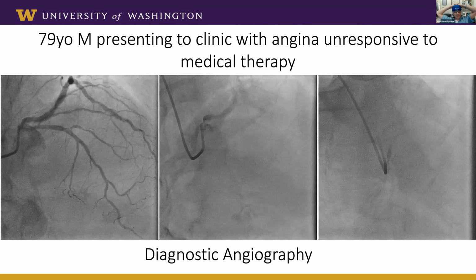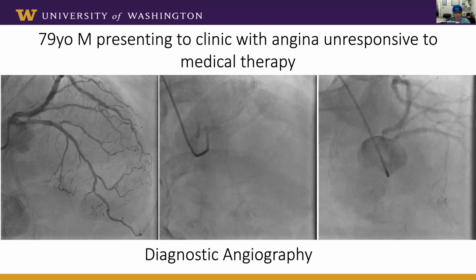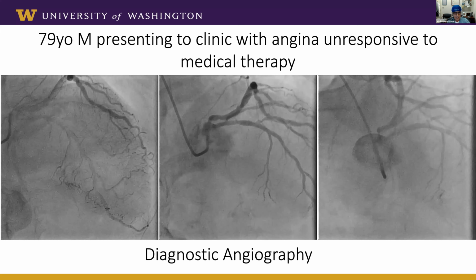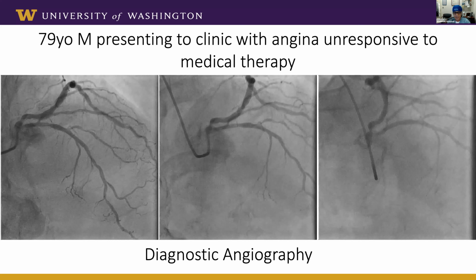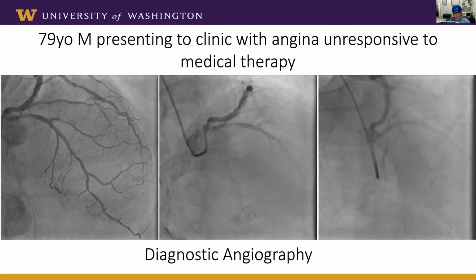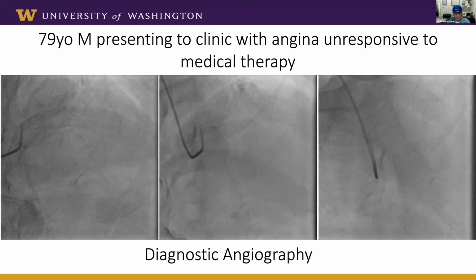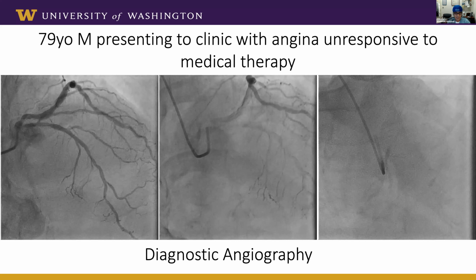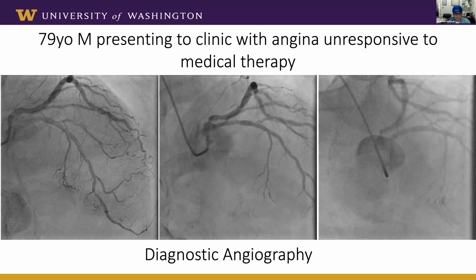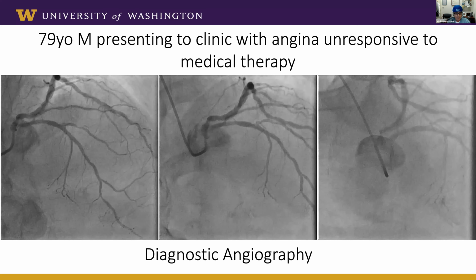Yeah, this is again a typical example about the limitation of angiography in left main disease. We really cannot tell if there is left main or no left main, if there is common ostia, and if there is a left main, whether the disease extends into the ostial LAD and ostial circ, or just the ostial circ. This is quite an example about the limitation of angiography in a left main. We're going to talk about it later, how you're going to have to use other adjunctive technology to basically figure this out.